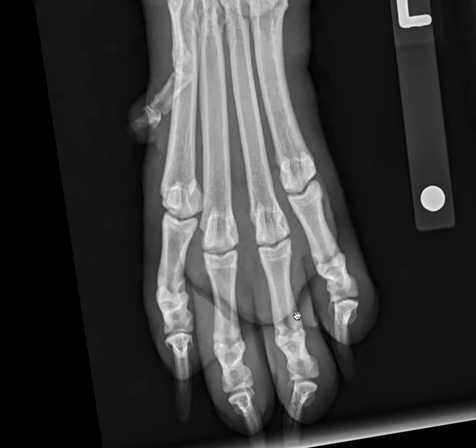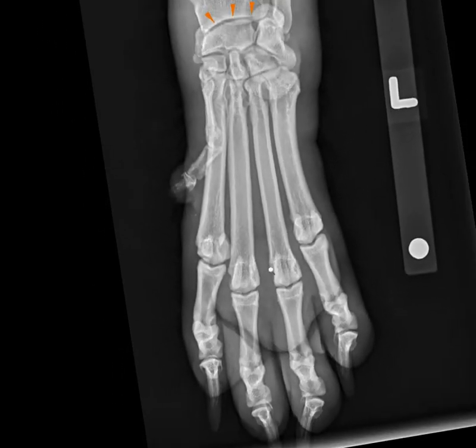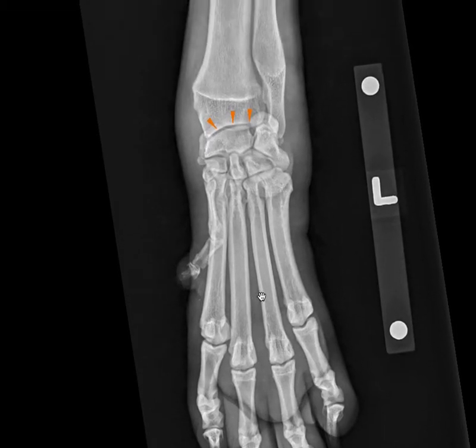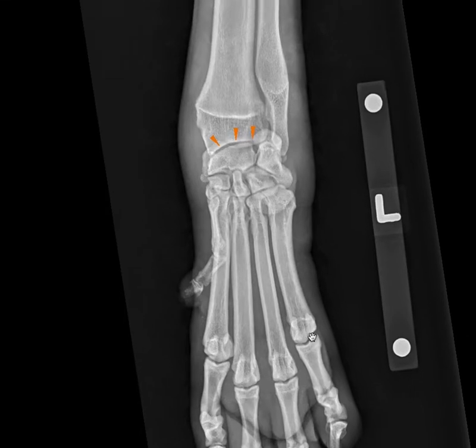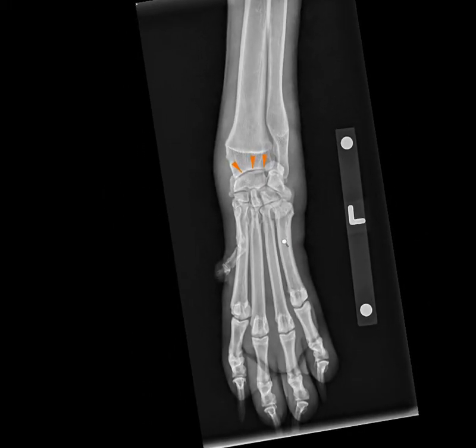For those dealing with equine species, we can have a lot of superimposition and obliquity of joints because the joints are simply so large. The next step after C for cartilage would be D for devices, which are not present here. So let's move on to S for soft tissues.